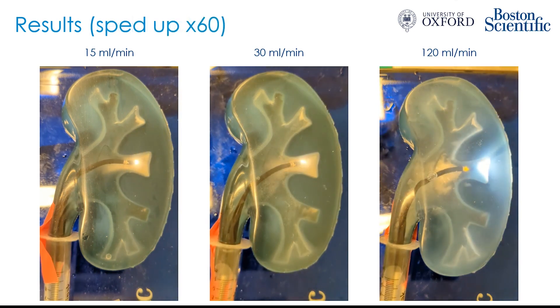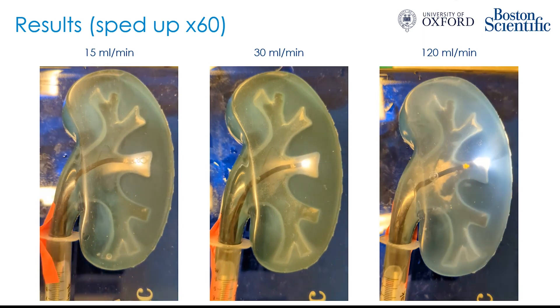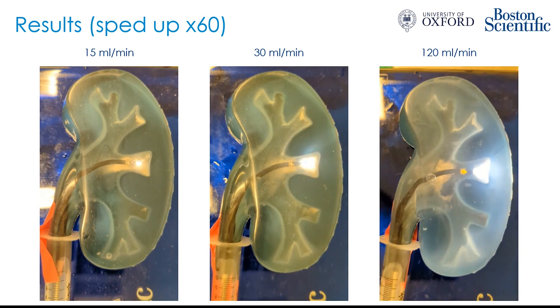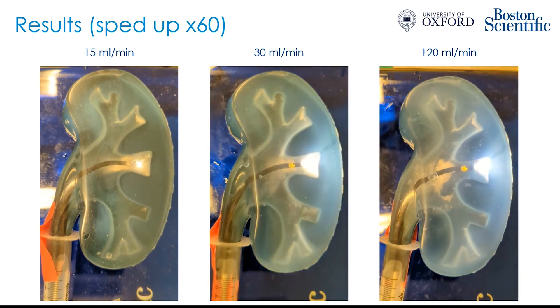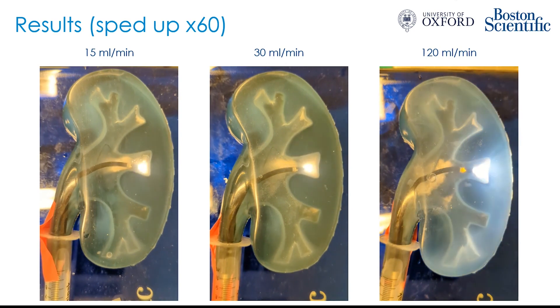Here are the same videos, but sped up 60 times, so you can see the entire 30 minutes of irrigation. On the right at 120 mils per minute, you can see that the calyx is completely clear, but the majority of the dust still appears to be in the renal pelvis, not having washed out of the kidney. At the lower irrigation rates, there's still substantial amounts of dust in the calyx itself, and most of the dust appears to be sitting in the lip going towards the renal pelvis.